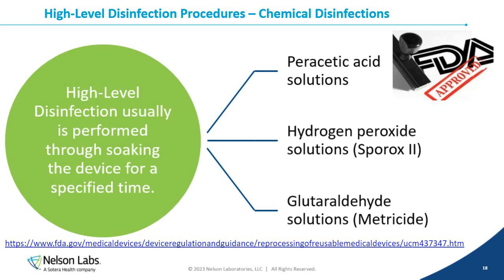For high-level disinfections, these procedures for chemical disinfections are usually performed through soaking the device, so fully immersing the device into that high-level disinfectant and allowing it to soak for a specified time. That time is going to range anywhere from 12 minutes to 45 minutes to 90 minutes.